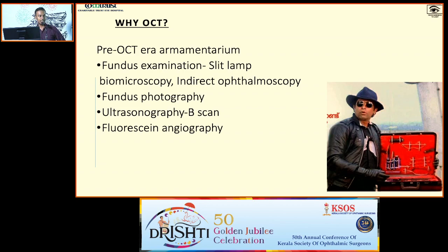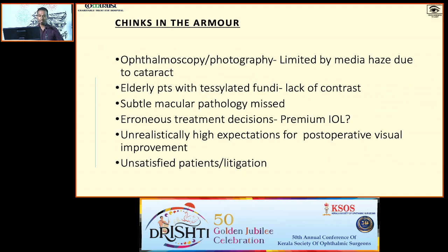So, these were relatively lacking, as you can see. Certain lacunae were that ophthalmoscopy is severely limited by media haze, and in elderly patients with tessellated fundi, there is total lack of contrast, and we are unable to pick up subtle macular pathology. So, this leads to erroneous treatment decisions.